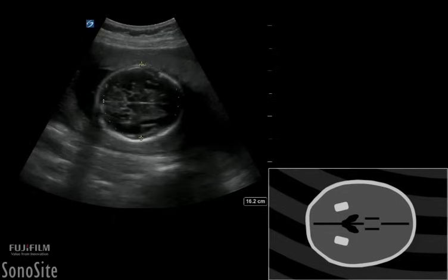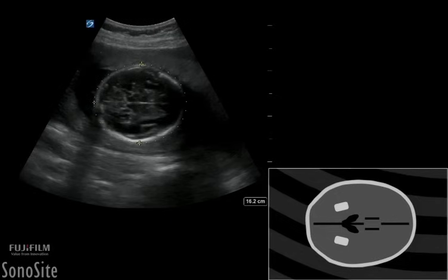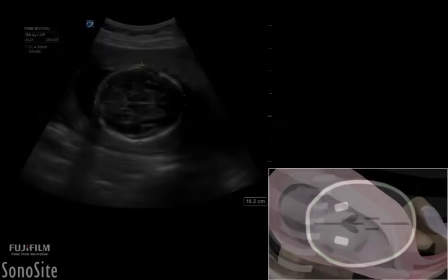From this scan plane, the head circumference can be measured by placing the distal caliper to the outer edge of the distal skull and employing the ellipse feature around the outside of the skull bone echoes to approximate the shape of the skull.